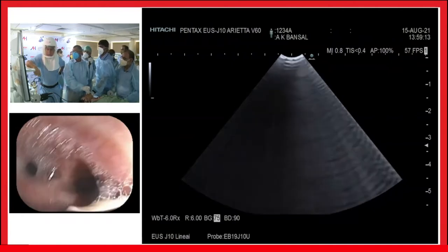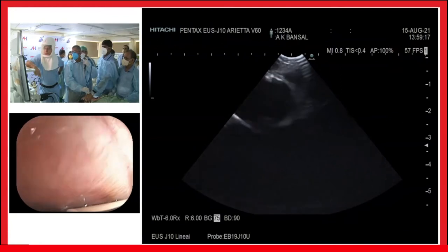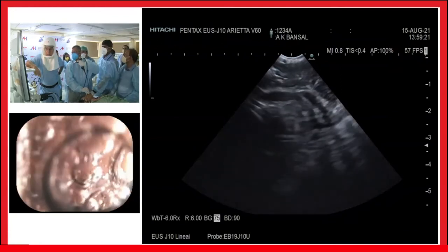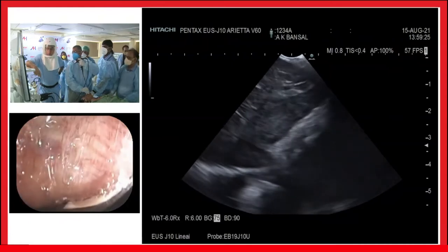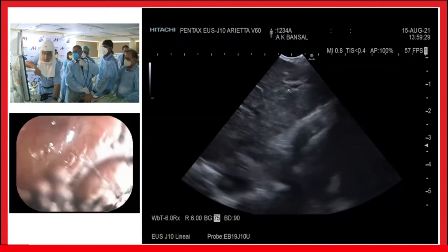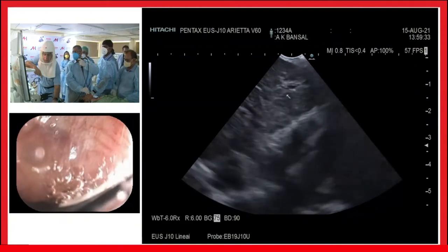Okay, so this was a quick demonstration of the station 7 lymph node. Let me go into the left main bronchus to show you the same. It's not going to be very different, just the fact that there are two approaches to it. So you can see a nice big lymph node out here again, and you can definitely see the intranodal vessel, which sir is pointing out with the arrows.